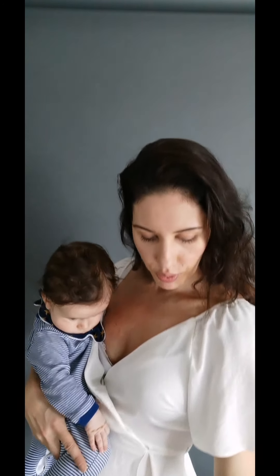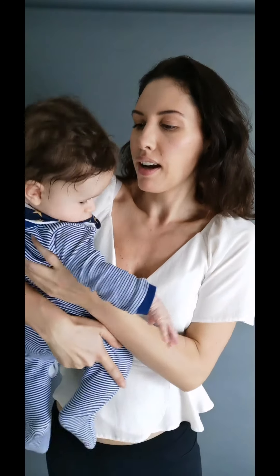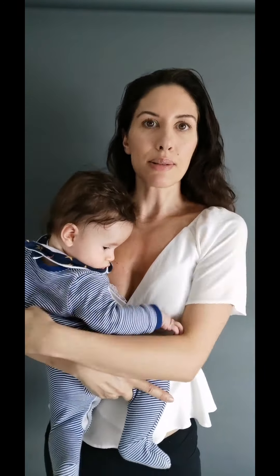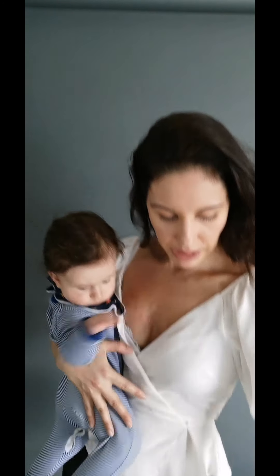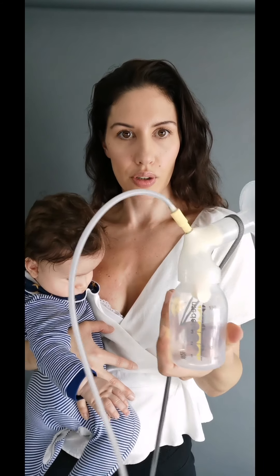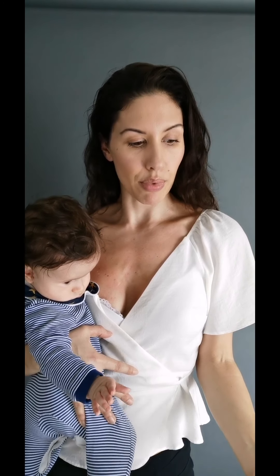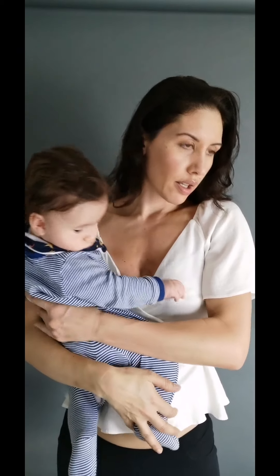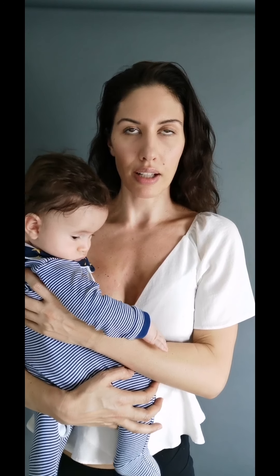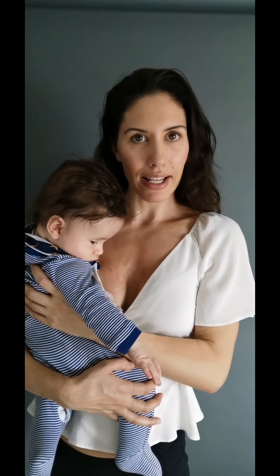Is it quick? After all, the whole point of pumping is because you're a busy person with places to be. I would say it depends on your anatomy and how full you are, but on the whole it is quite slow. On a good day, if I was really full and hadn't fed Oren for a while, I could probably fill that 150ml bottle in about 15 minutes. On a bad day, more like half an hour — so it can be a bit of a drag sitting there pumping.